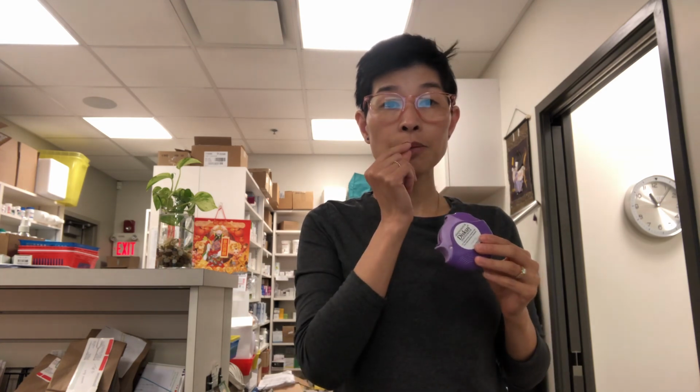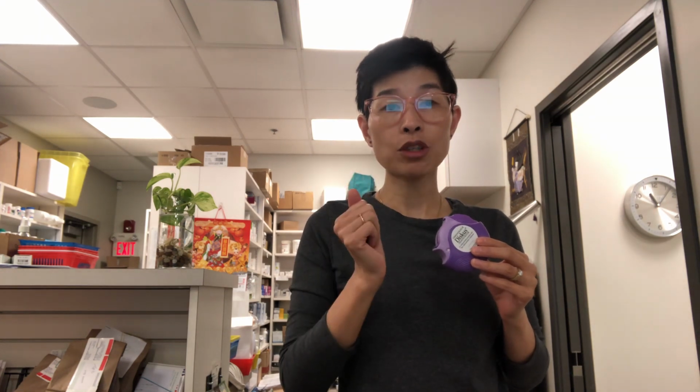Then you close your lips and try to hold your breath for about 5 to 10 seconds and blow it back out with your nose. So the whole procedure looks like this.